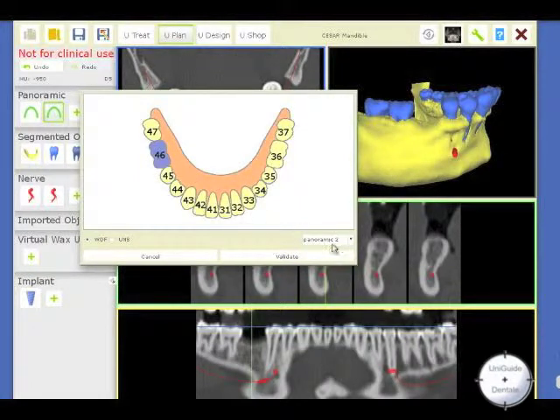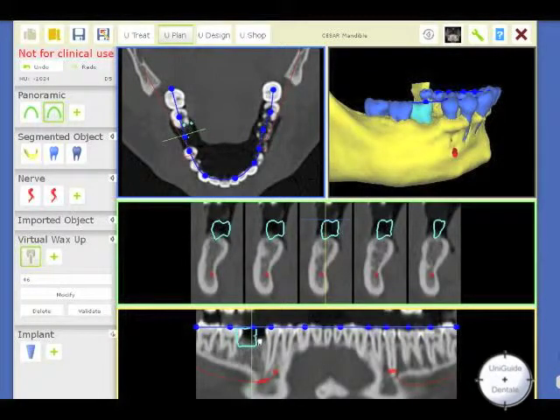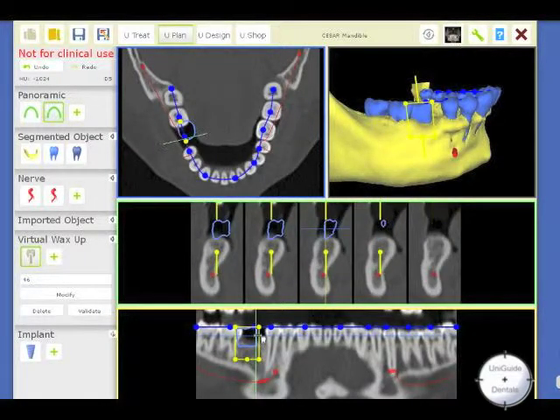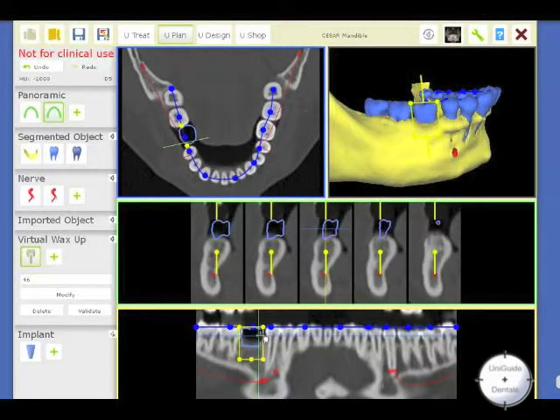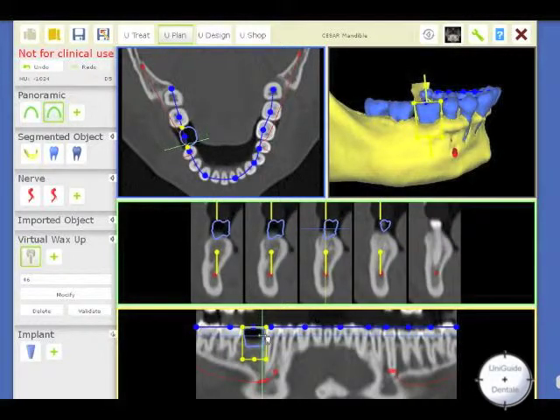Select Panoramic 2 and validate. Almost immediately, you have your tooth here. I move it a little more visually.